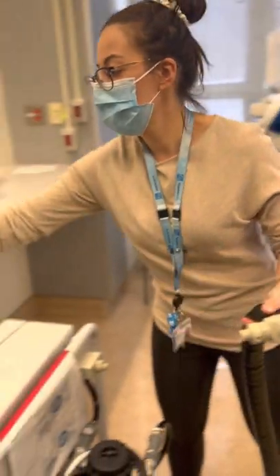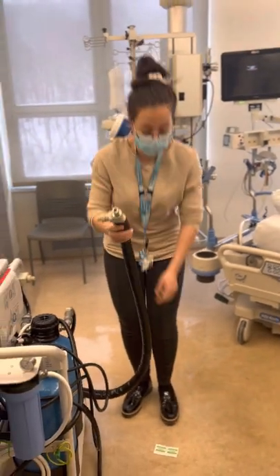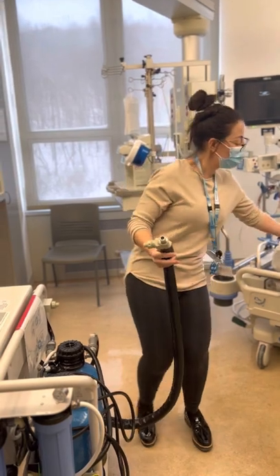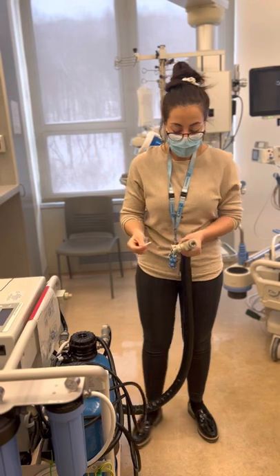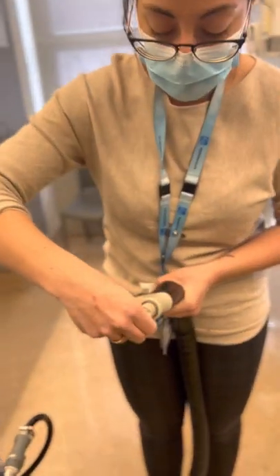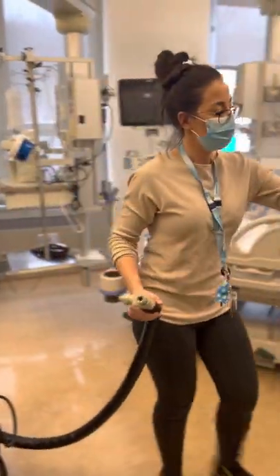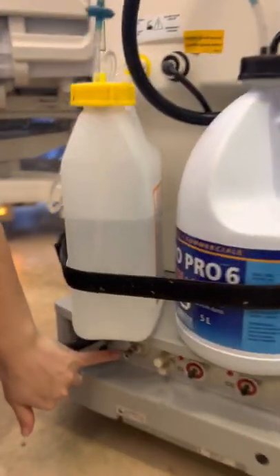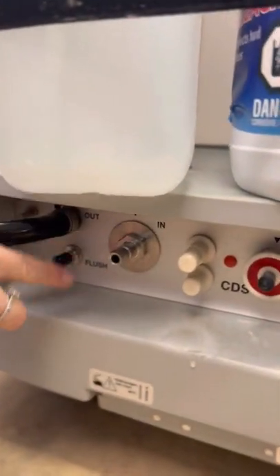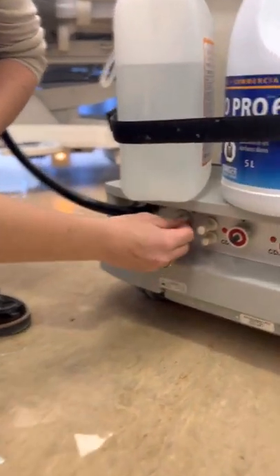We're going to clean the interior. All you're going to need is two alcohol swabs — one for this aspect and one for the dialysis machine itself. We're going to clean inside like so. Now I'm going to come over to my dialysis machine, and if you see down here, this segment is where you're going to connect your pure water. We're going to clean the outer aspect of this with an alcohol swab, just like so.